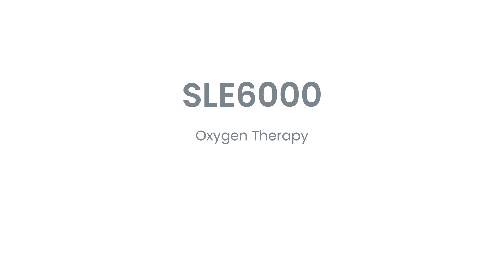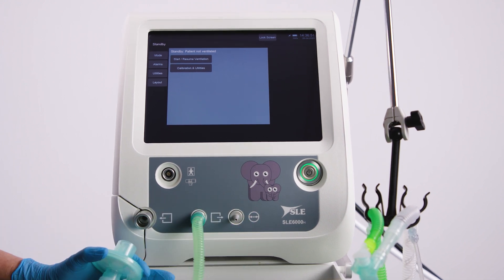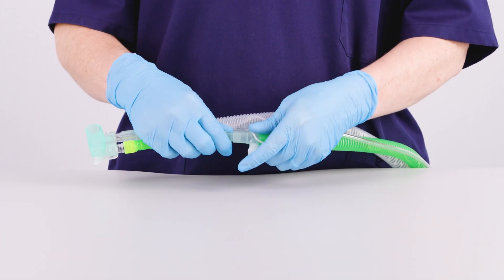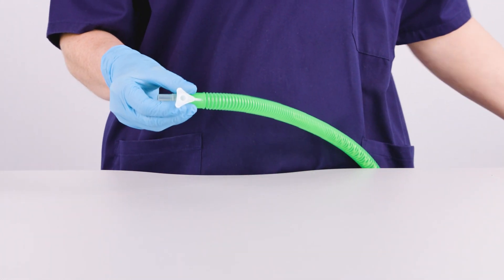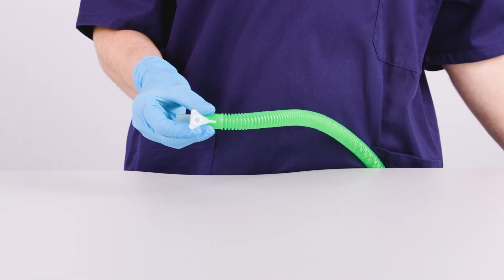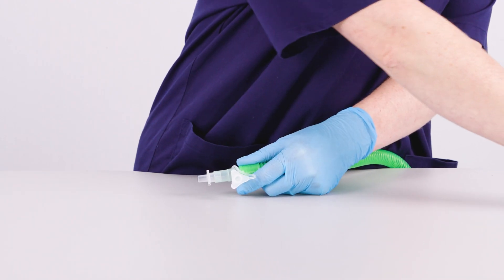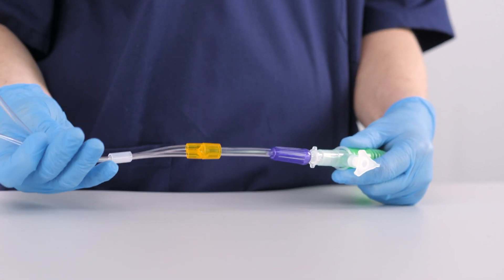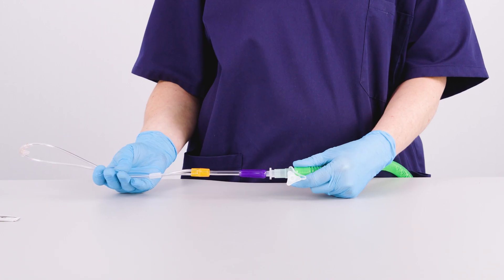Oxygen therapy: In oxygen therapy mode, the expiratory limb and proximal airway tube are not used. So first, disconnect both from the ventilator end. Disconnect the tube that contains the yellow restrictor from the rest of the inspiratory limb of the SLE6000 patient circuit. Use the C4318 adapter that comes with the F&P cannula supplied by SLE. Connect the adapter to the inspiratory limb and attach the cannula to the adapter. Make sure the yellow restrictor is not connected. You are now ready to use high-flow oxygen therapy mode.